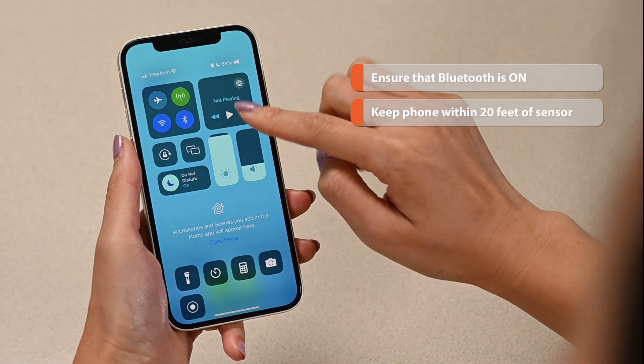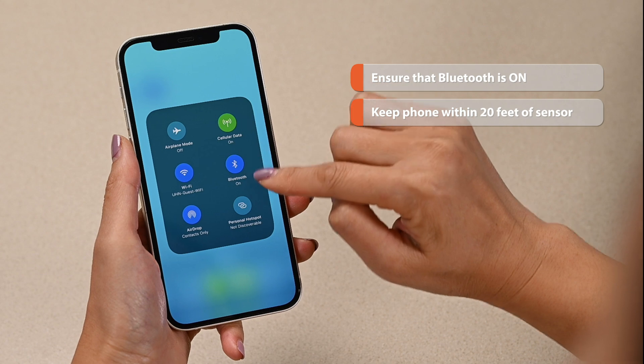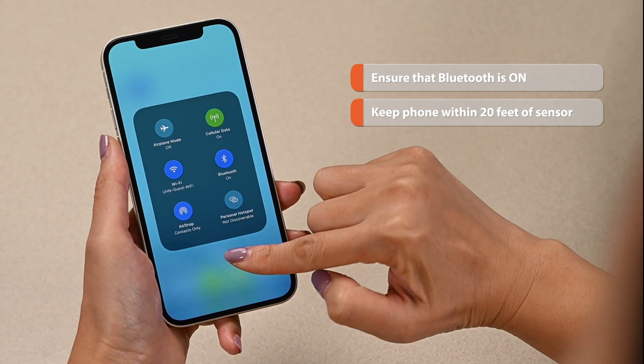Note that you must keep Bluetooth on and your phone within 20 feet of you for the app to continuously record your glucose readings.